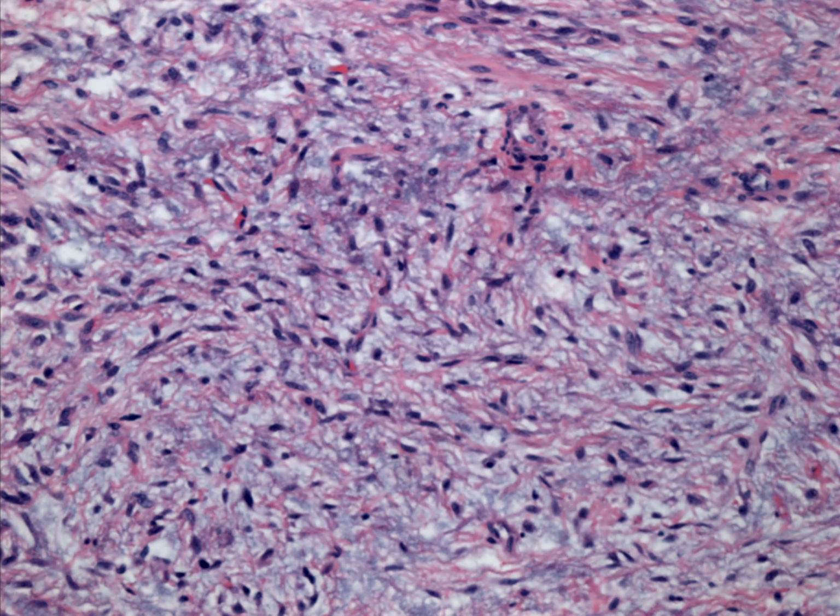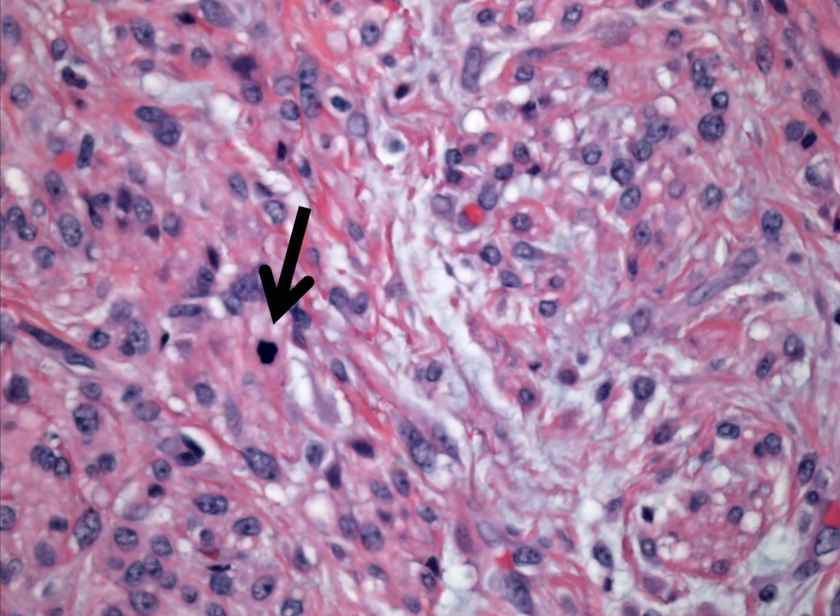Here we start to get into areas that are a little more cellular. This is a little more concerning to me. There is some nuclear atypia in here, which makes me sit up and pay attention, especially since it's a myxoid lesion. Your thresholds can be a little bit lower. We're going to get into the diagnostic criteria here in just a minute. And then I started seeing mitotic figures.